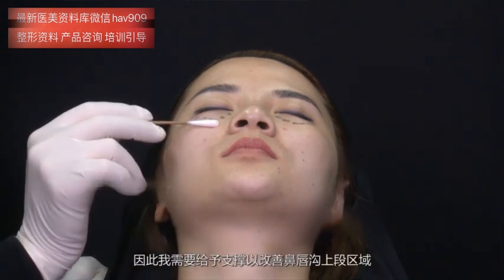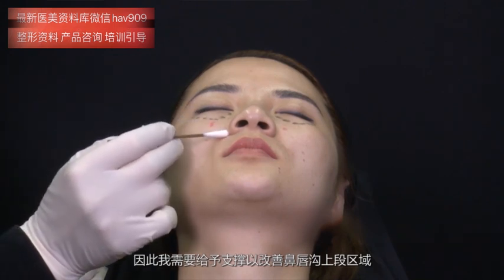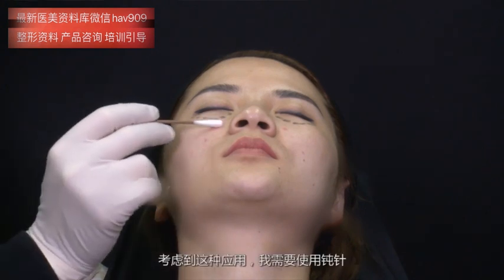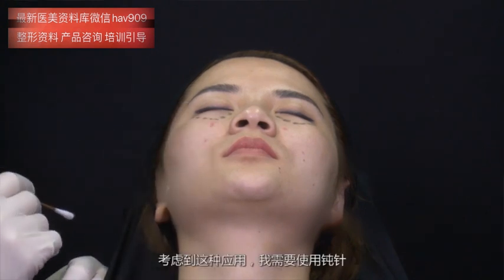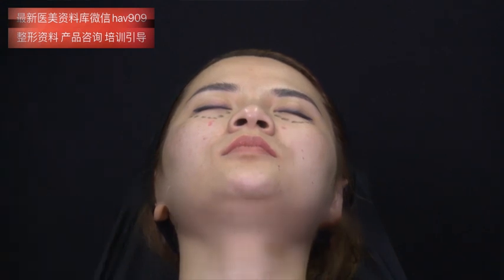So I need to give support to reduce the upper part of the nasolabial folds. But for this indication, I need to proceed with a blunt cannula.